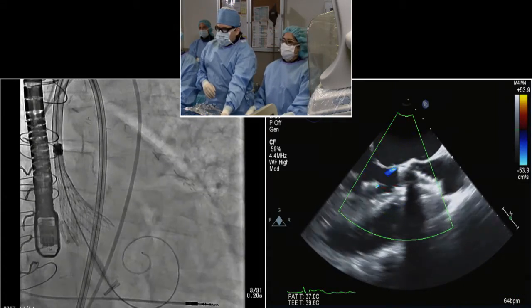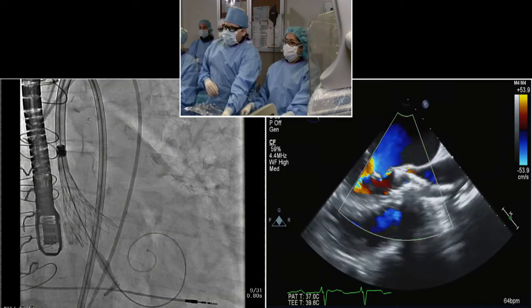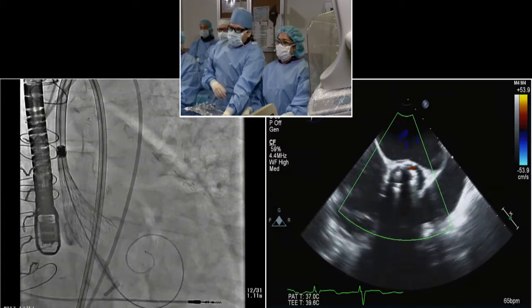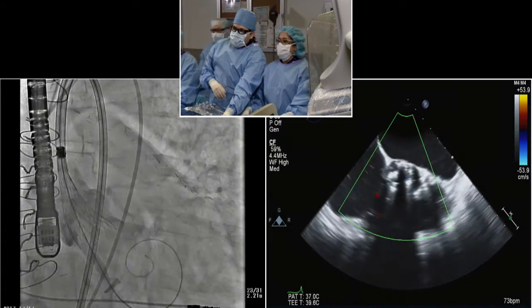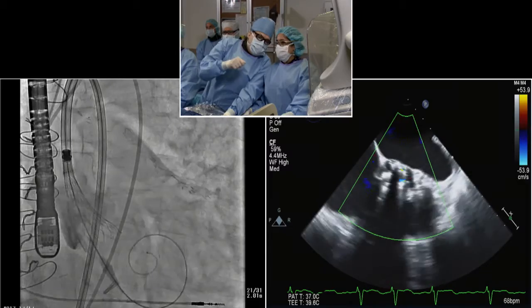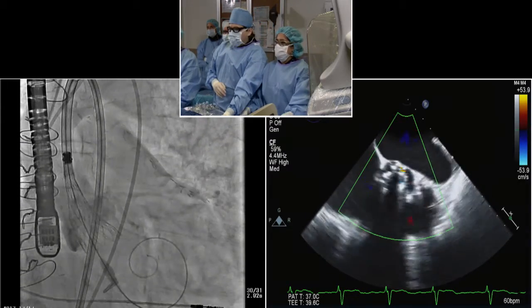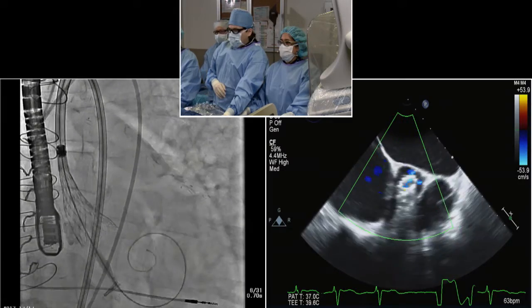It seems that you're a bit higher, I think. I'm not sure. No, I think I'm almost in the same place. Yeah, pretty much exactly what happened. I feel like we're exactly where we were. So just having a look around, Patrick. Let's say the AI is about the same. No, it doesn't change it. What's the degree of regurgitation, Patrick? Yeah, I would say it's mild.